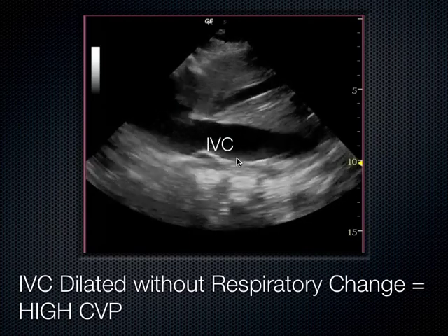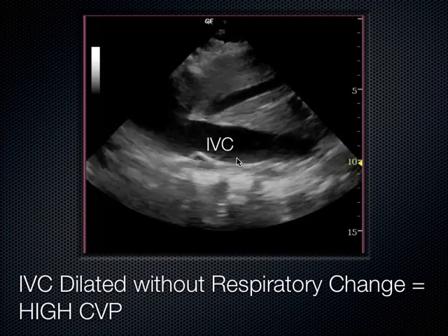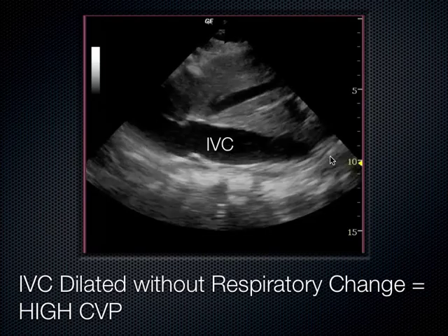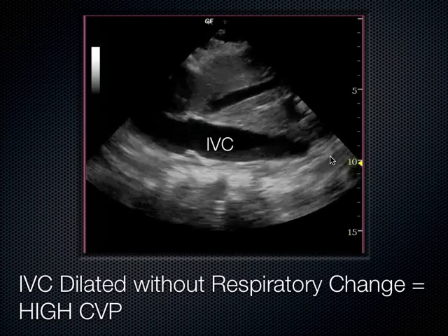Any questions about the IVC, CVP stuff? Okay. Yes? So when you float a filter, where is it going to land? The filter lands much more distal to this. Usually down lower. Distally, not underneath the liver, but distally, typically.